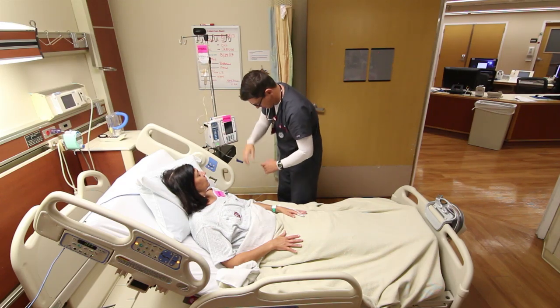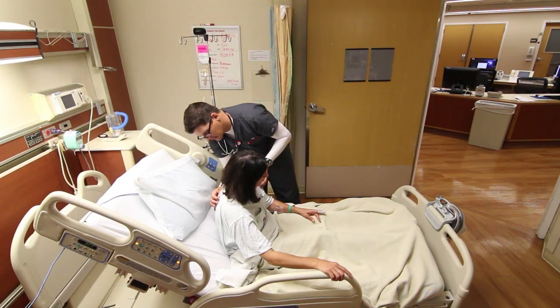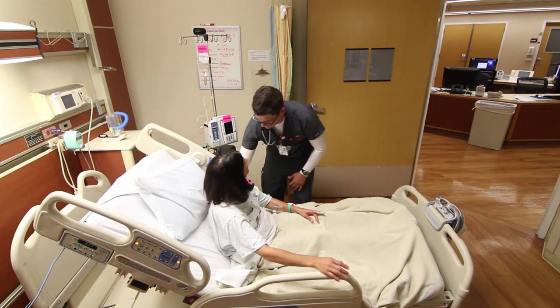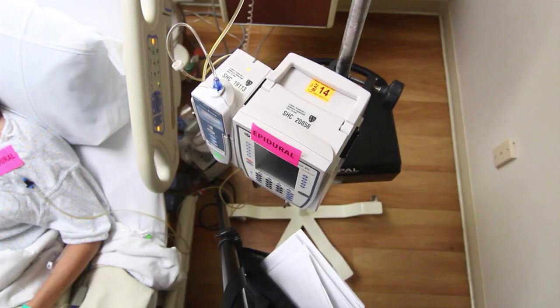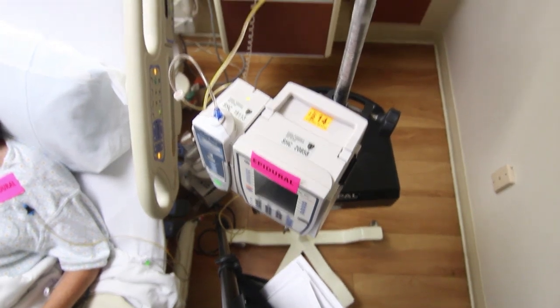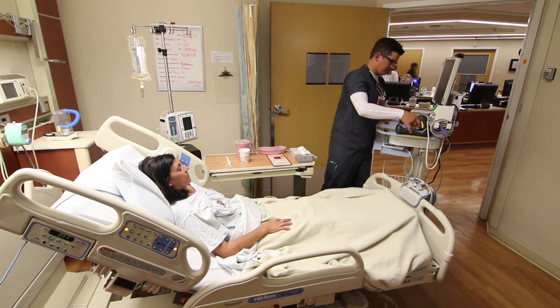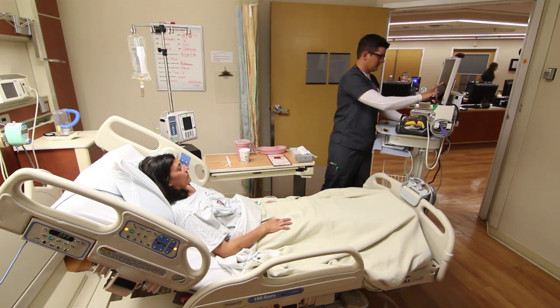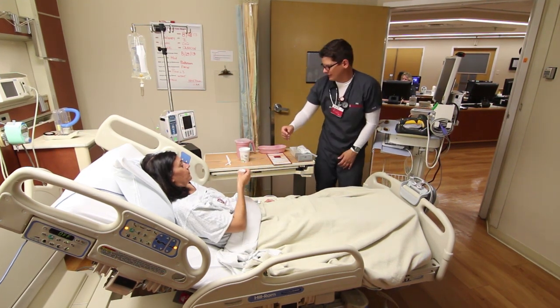An epidural catheter is a small flexible tube placed into the epidural space, the outermost part of the spinal canal of your spine at the lumbar, lower back level. This catheter is connected to a pump that introduces pain medication continuously. As quickly as possible, you will be transitioned to oral medications that are very effective for pain control.